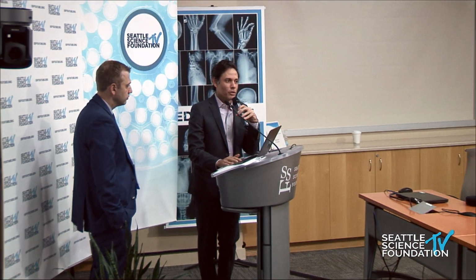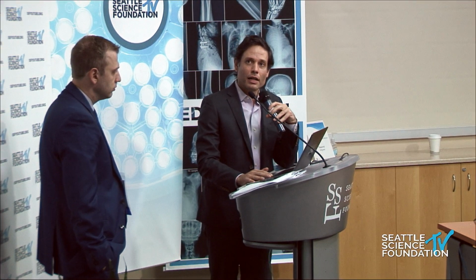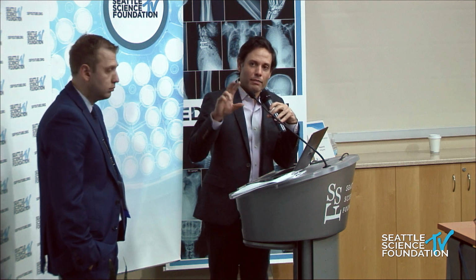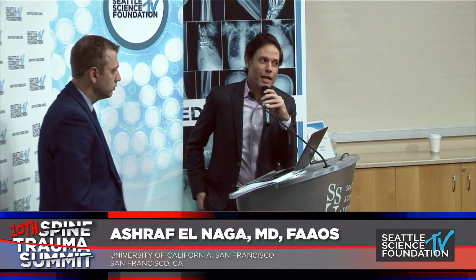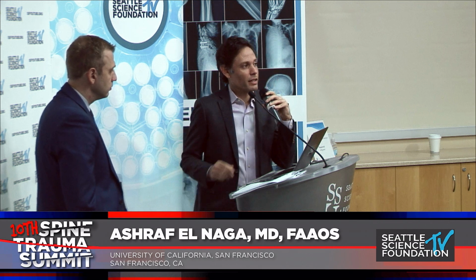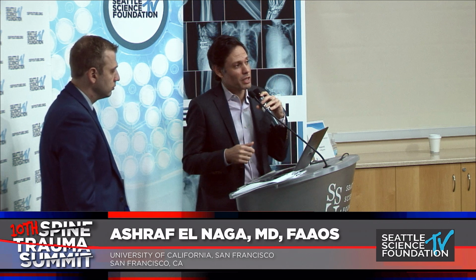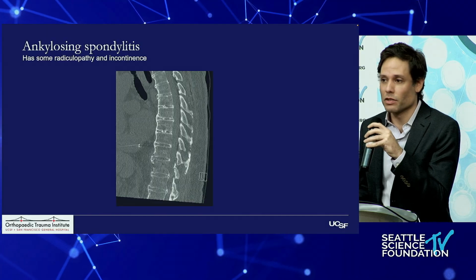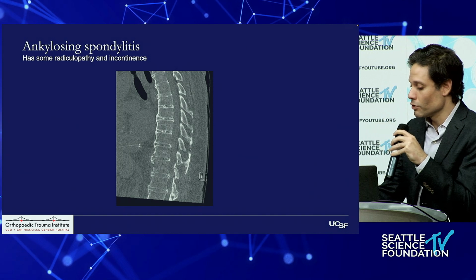It was a B3 type injury, a hyperextension injury in the setting of an ankylosed spine. The plan was to instrument this. Because I had enough concerns about a local compression because of the urinary retention that was new and the L1 symptoms, I wanted to do a decompression too, at least at the level of the injury.